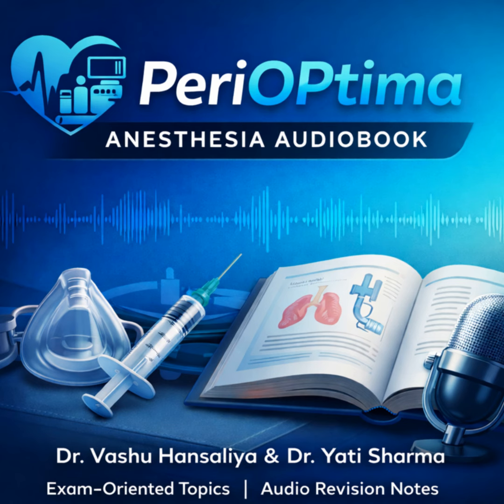And the safety net, oxygen supplementation. Pre-oxygenate with 100% O2, of course. But you need to provide supplemental O2 throughout the entire procedure. You can use nasal prongs, and for a higher scoring answer, you should mention this. You can actively insufflate oxygen through the FOB suction port. This also helps blow secretions away from the tip.